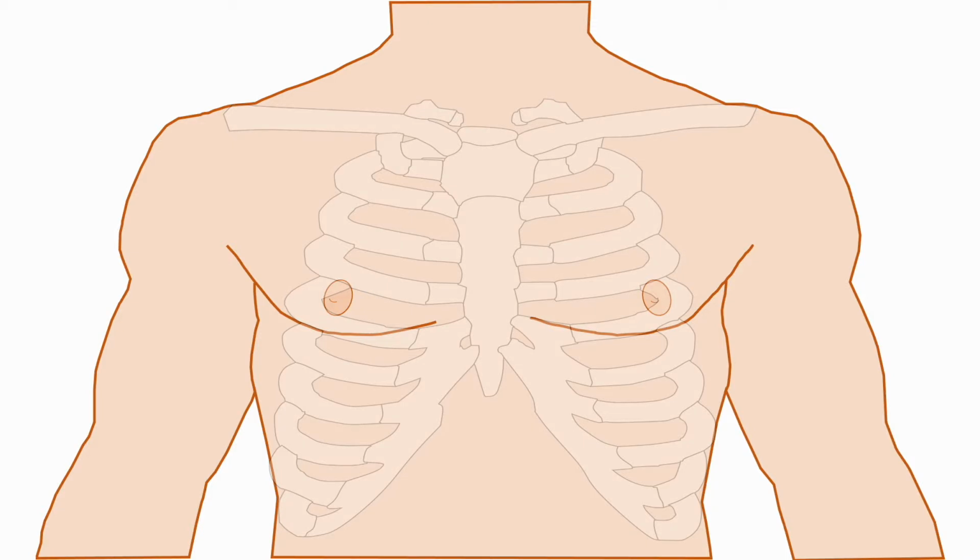Let's talk about setting up and obtaining a 12 lead. First, let's start with prepping our equipment and explaining to the patient the process and the importance of getting an EKG. We'll start placing our leads by using the limb leads first, and this will get us our 4 lead. The patient will need to remove their shirt and undergarments from the chest and arms. Pants and socks will need to be pushed aside on the lower legs as well.